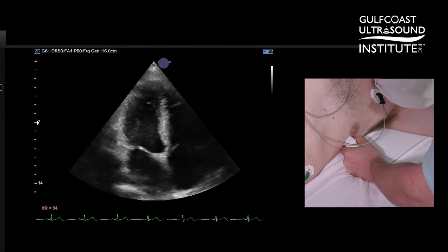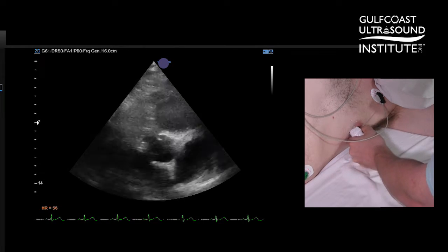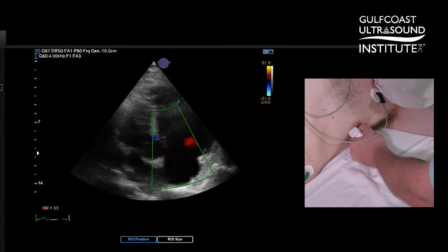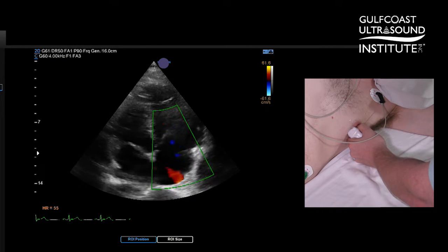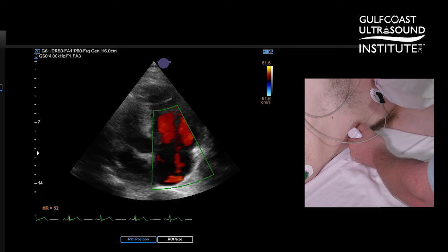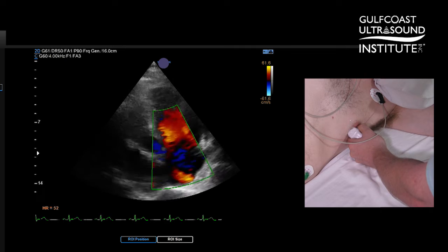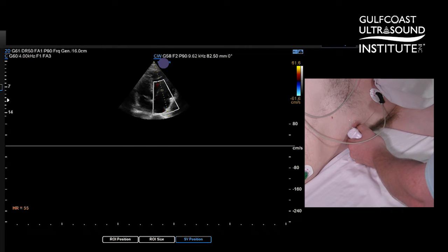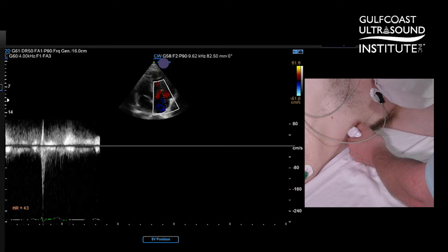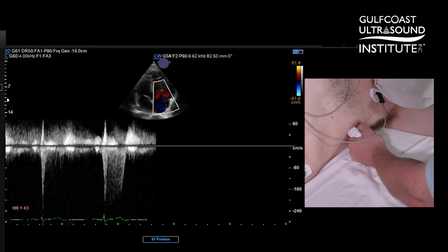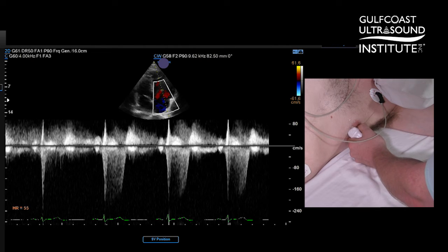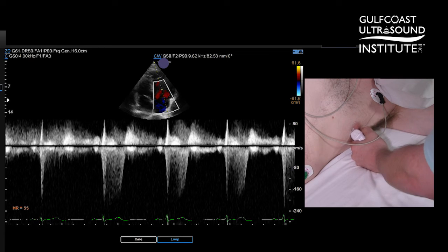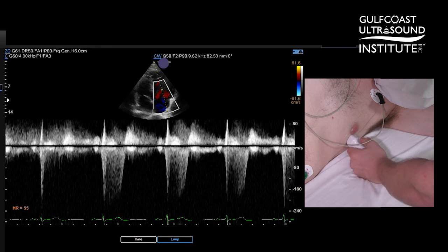This again can be another window — if I go slightly off axis here — where you might get more parallel alignment for your tricuspid regurgitation jet. No real difference from our other view from the modified apical four-chamber, but just another tip.